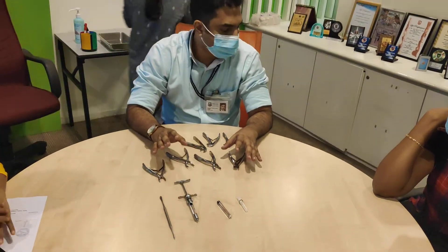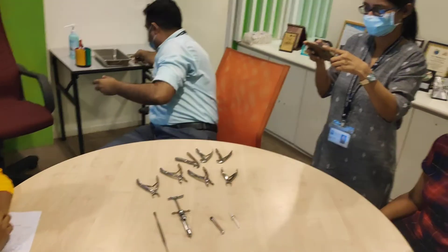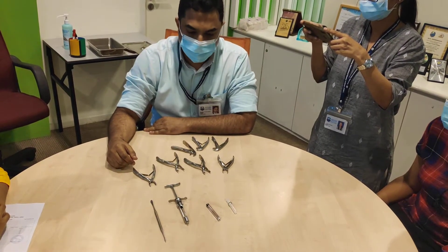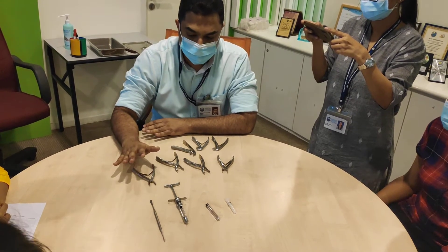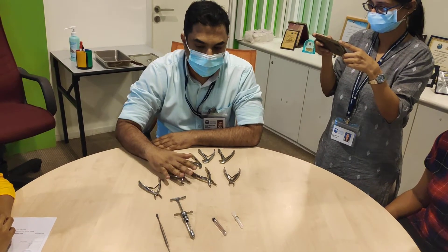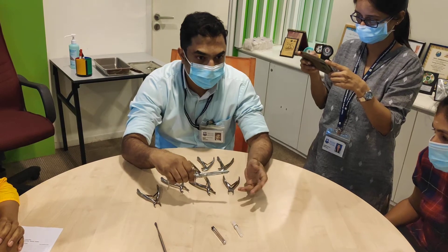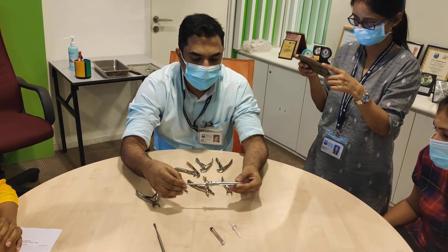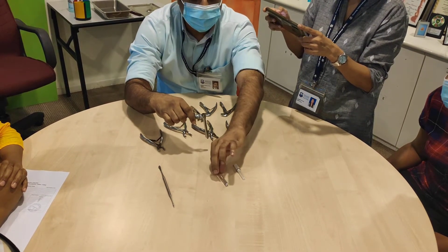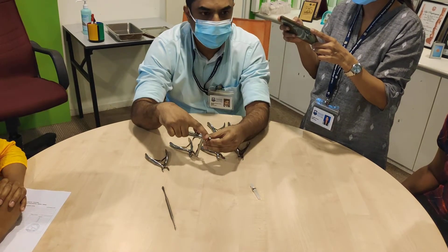Hi everyone. Today we are going to discuss forcep selection for extraction of primary teeth. Before we go to the forceps, we must understand how to load a LA cartridge. This is a metal syringe and it comes in various forms. How you open this is you pull the plunger and it rotates. Then you put your LA cartridge with the stainless steel part towards the inside and the rubber plunger to the outside.